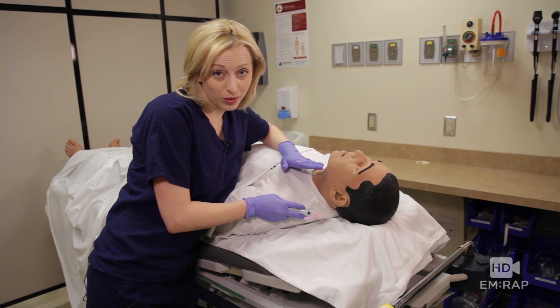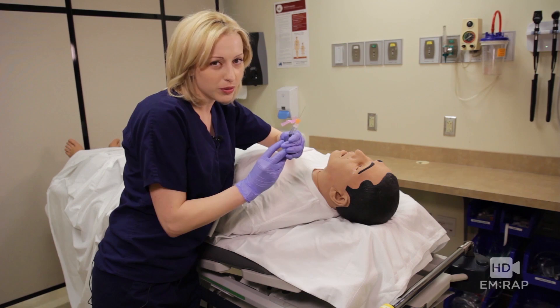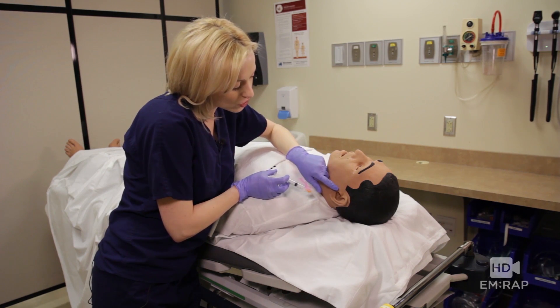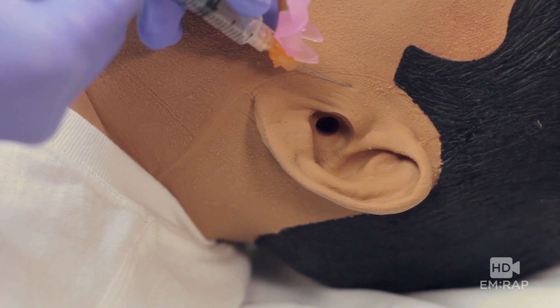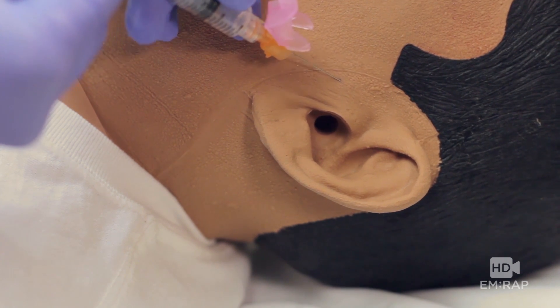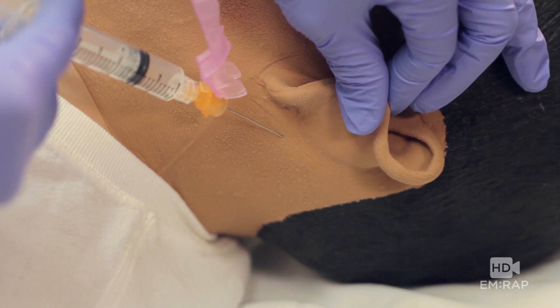Now this should numb up his whole ear, but just in case you're not getting good anesthesia, you can get a little bit more lido and inject just anterior superior to the tragus right about there. You can also give a little bit more medication behind the earlobe in the posterior sulcus right here.